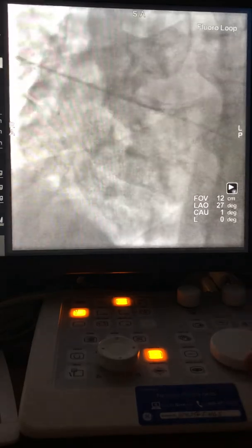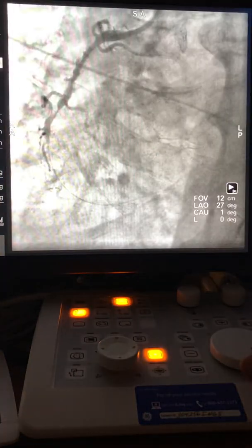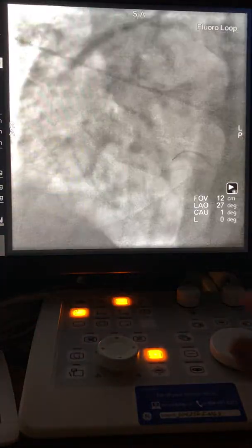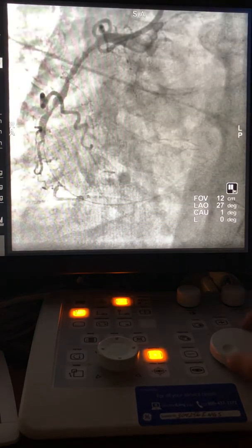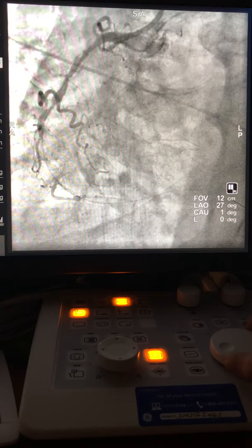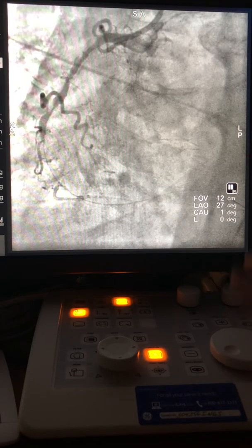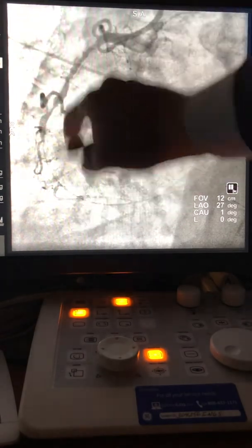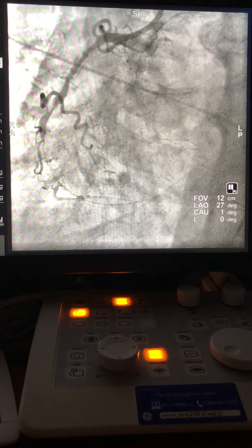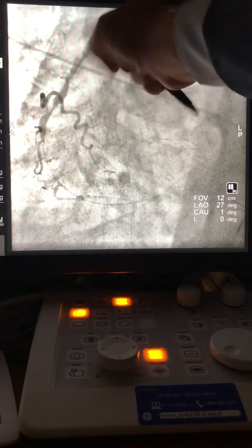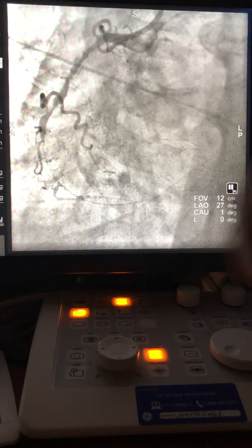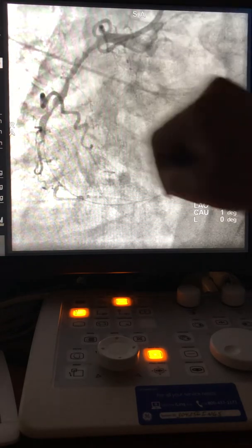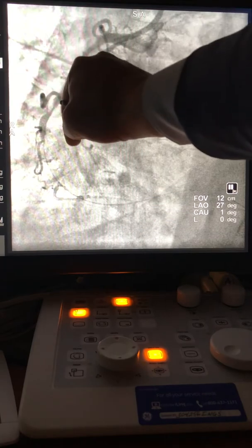The 1.5 balloon did not pass through, so I went to 1.25 to pass that area. The 1.25 also did not pass through this CTO area. What do you do? You already have the wire. The trick here is to support with a guide liner. Putting the guide liner here will damp the pressure and risk dissection — that dissection can propagate — so fix from here to here with a stent to seal the area, stopping further dissection.